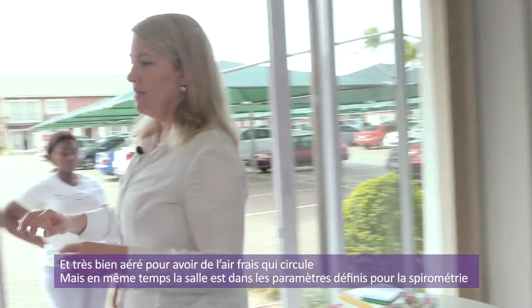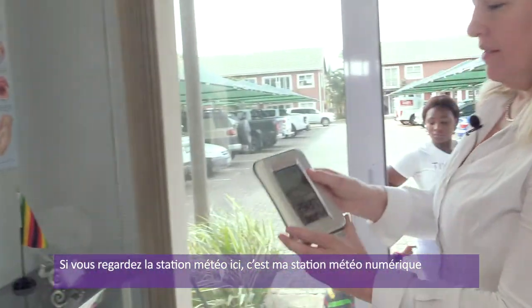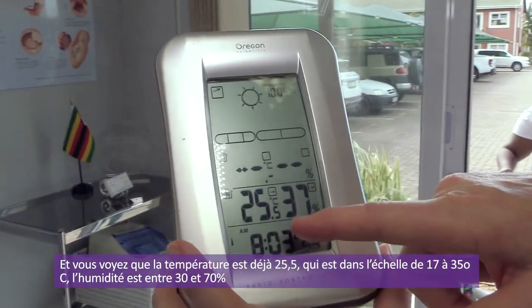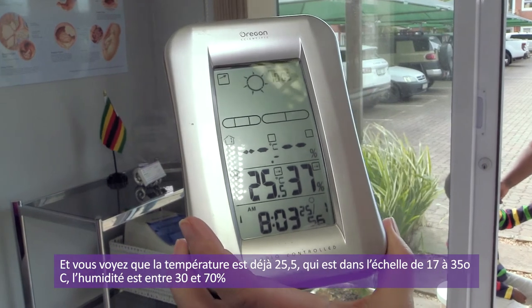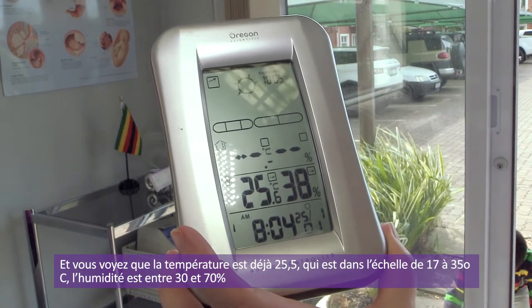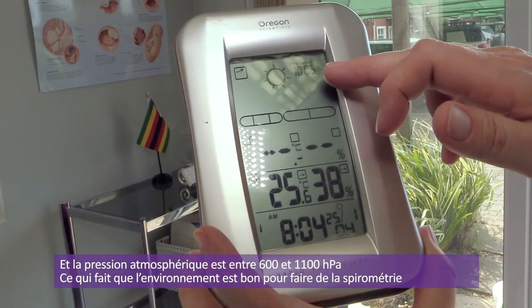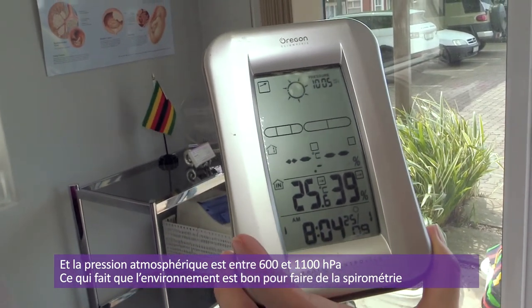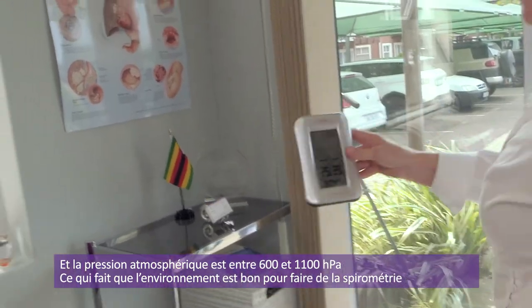You can see that it's very light and very well ventilated, so that we have some air flowing through, and yet at the same time the environment is within the ranges that it needs to be for spirometry. So if you look at the weather meter here, this is my digital weather meter, and you can see here that it's reading a temperature of 25.5, which is within the range of 17 to 35 degrees Celsius. My humidity is between 30% and 70%, and the pressure is between 600 and 1,100 hectopascals. So my environment is good for spirometry testing.